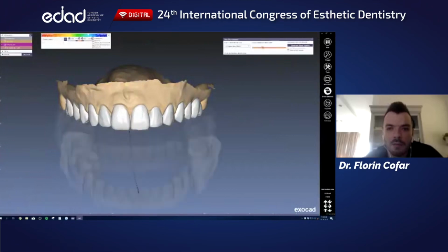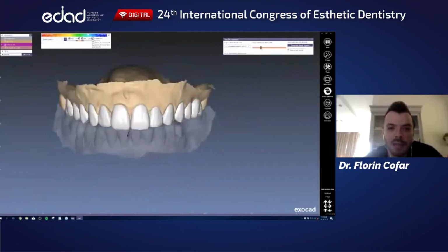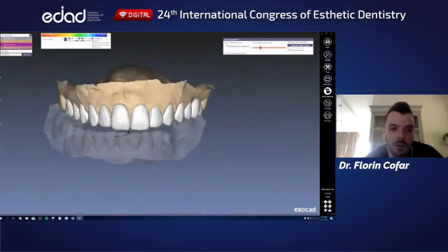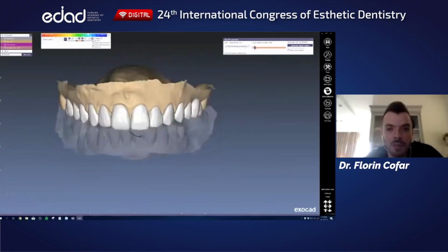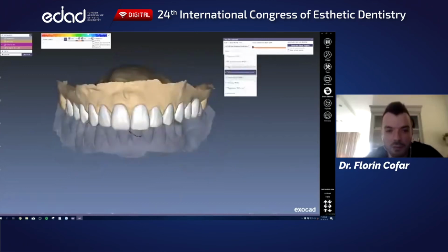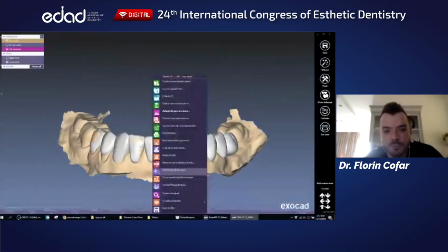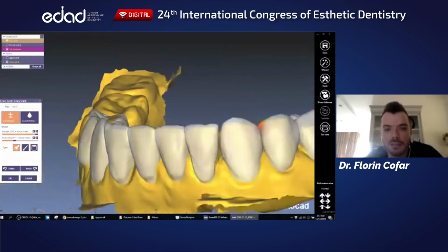And right now we have a few contacts because there is a little bit of a cant difference in the ortho between what was planned and what resulted from the surgery. So regardless, I will always adapt the situation to the design, not the other way around. So then we need to correct this small part. So we're going to take a library in the lower, and again we're pretty much going to do the same thing, erase the parts that need to be deleted.